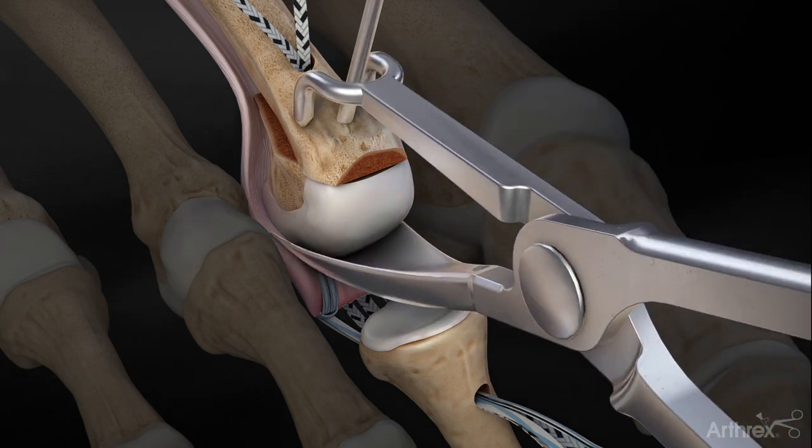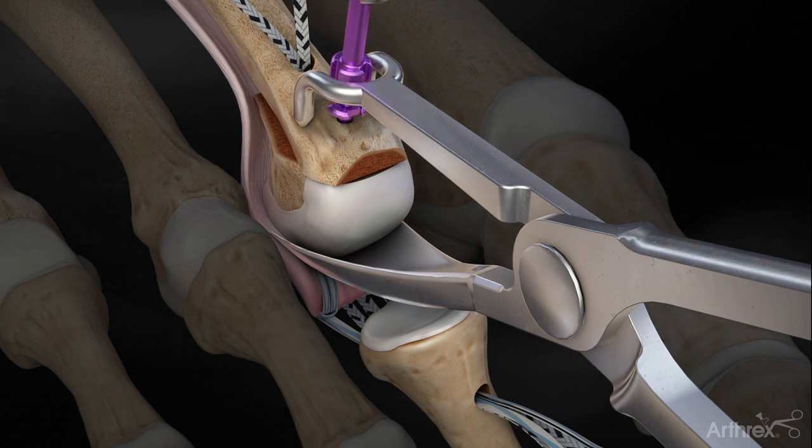At this point, place a quick-fix clamp at the site of the metatarsal osteotomy, remove the temporary K-wire fixation, and proceed to place a quick-fix screw to fixate the osteotomy.